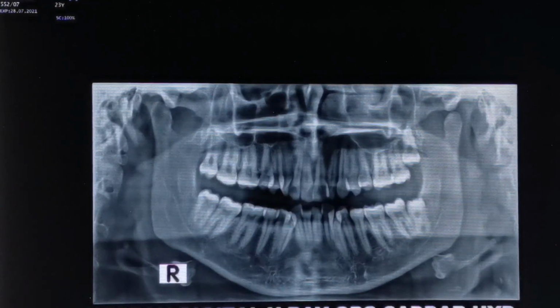So now moving on to another field, endodontics or operative dentistry. Why do a few dentists, endodontists, do this kind of X-ray? If the patient comes to the department with a complaint of pain all around the teeth, the patient cannot judge where the pain is heading towards. So this OPG is done to detect any kind of infection which is lying underneath the teeth.